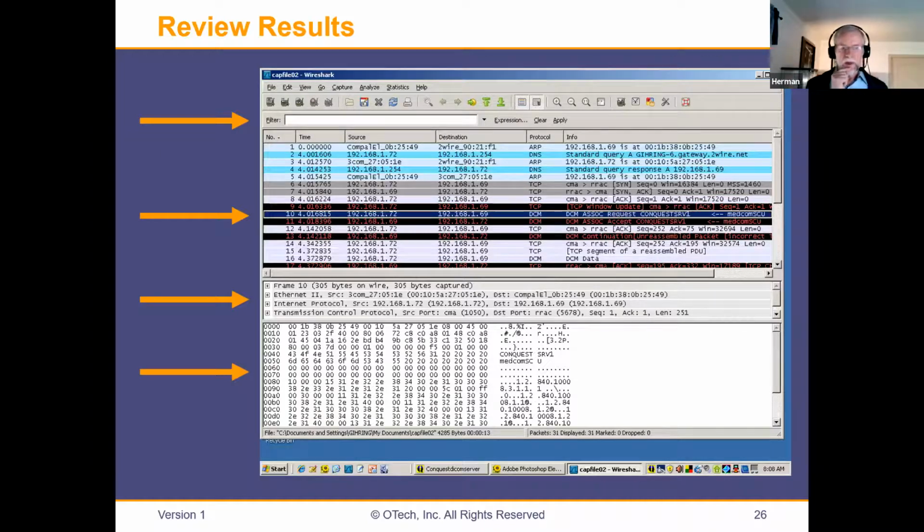When you run Wireshark, we see this on the screen. Remember I talked about Ethernet, TCP/IP, and application level packets. On the bottom, we see the data, all these bits and bytes. The only reason I ever might look at the real data is if I look for control characters in the metadata that do not show up. The most obvious one is the space.